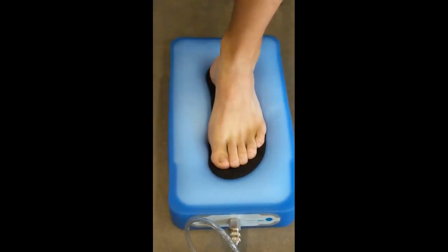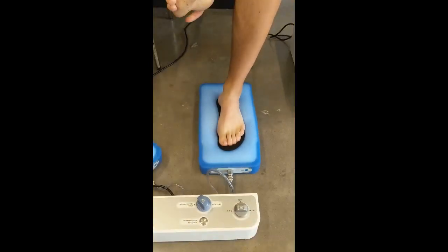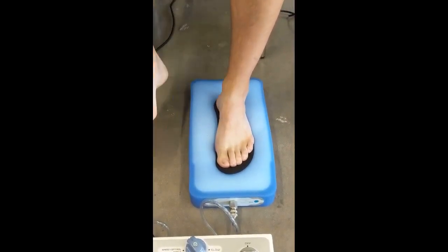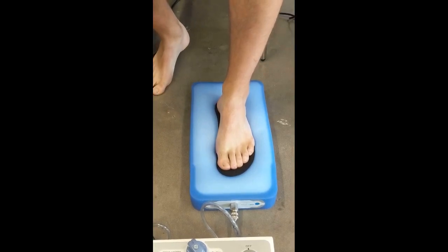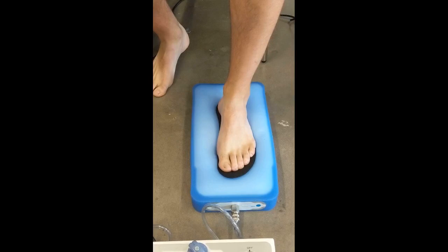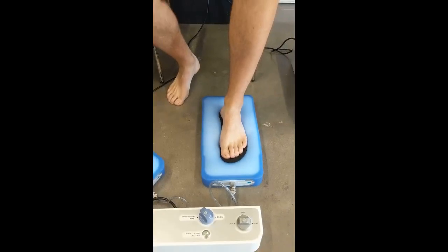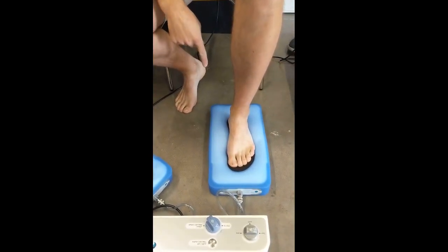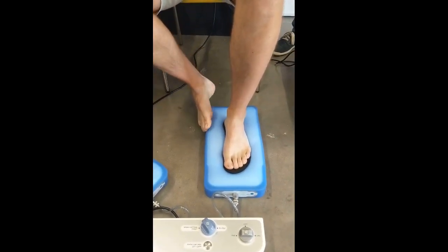The Kirby skive literally contacts the medial side of your cal and throws your foot out so you're not putting pressure through there. If you've got someone with a very hypermobile, very lax foot, you're going to put lots of pressure on the arch, so you allow it to collapse a little bit. That puts pressure on, but then the Kirby skive of the heel takes all the pressure off. I can feel that's mega, and I've only put like two thin layers together.